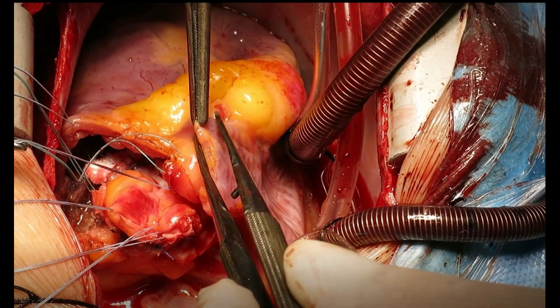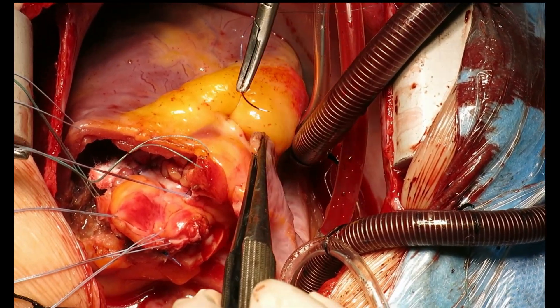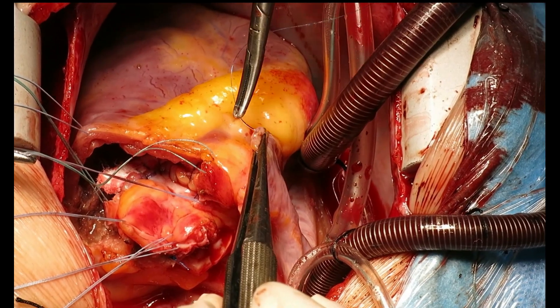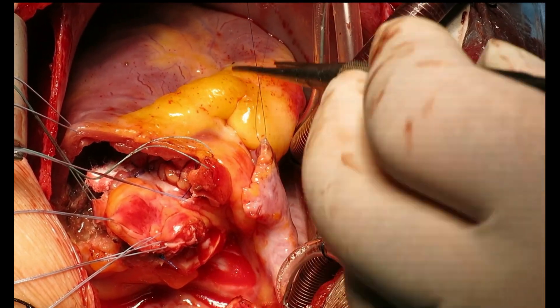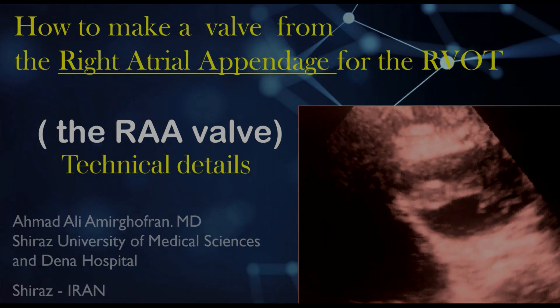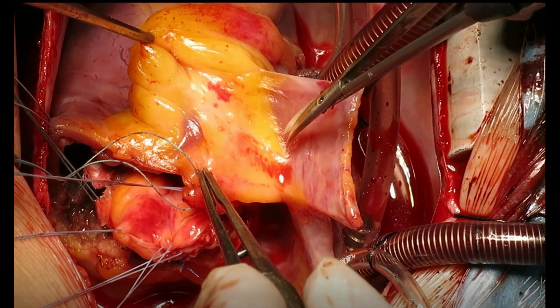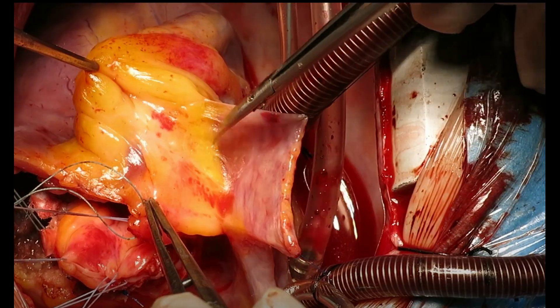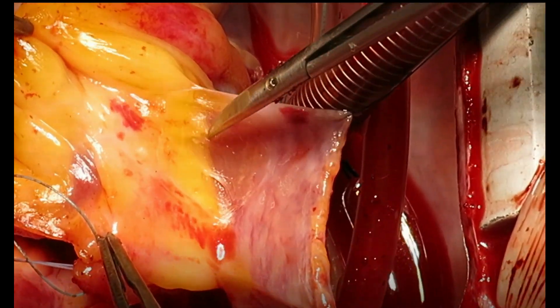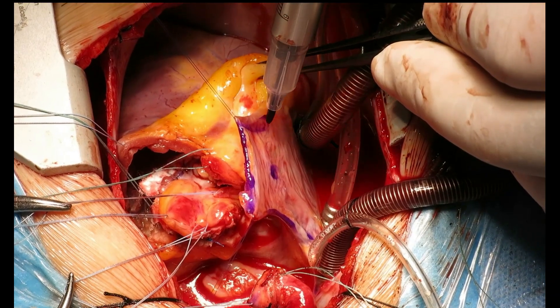Now we turn our attention to harvesting the RAA valve. The detailed technique of preparing the RAA valve from the right atrial appendage is available in another CTS Net video, which you can see here. Briefly, the RAA corners are controlled and retracted by sutures, and the important maneuver of releasing the loose attachments of the appendage to the right ventricle is performed.